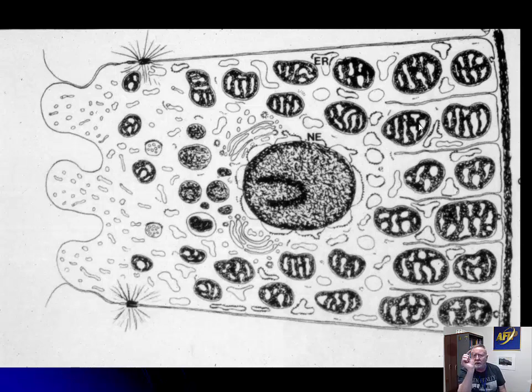So the cristae, which are normally long and thin, are becoming sort of fatter, and this causes an increase in density of that matrix, which is getting compressed. So it's actually darker than normal. So this is more cristae swelling than a true degeneration of the mitochondria.